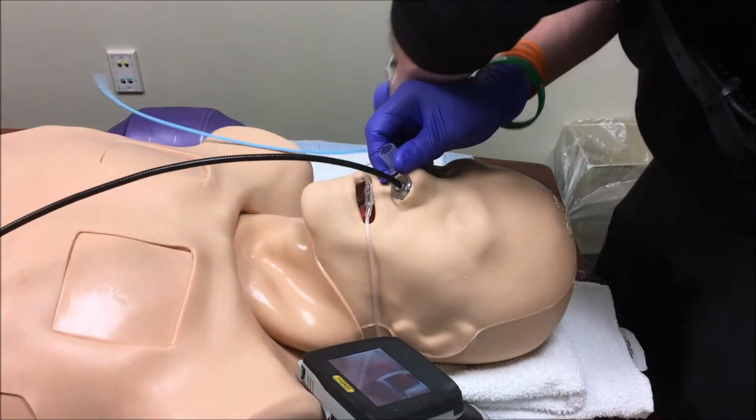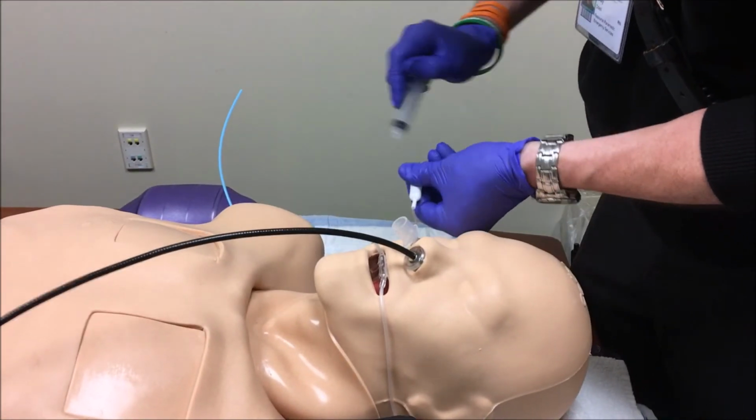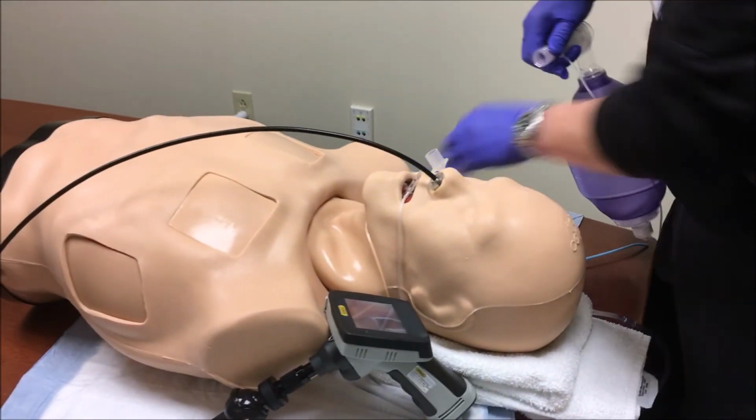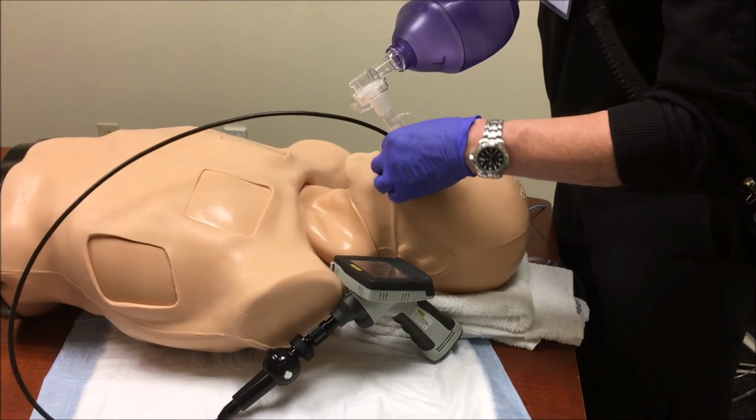Once passage of the distal cuff through the vocal cords is observed, the cuff is inflated, the bougie is removed, ventilations begin again, placement is confirmed, the endoscope is removed, and the tube is secured.